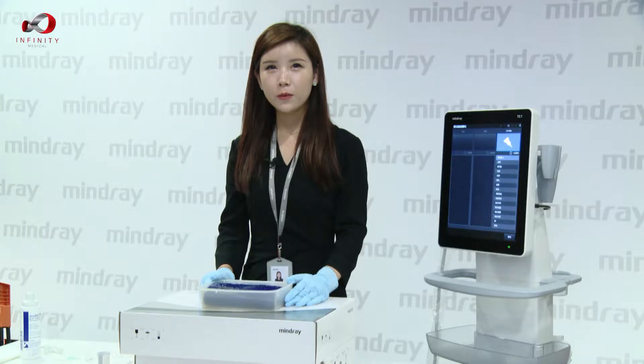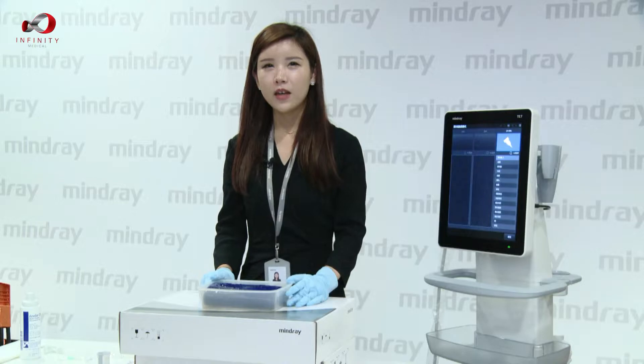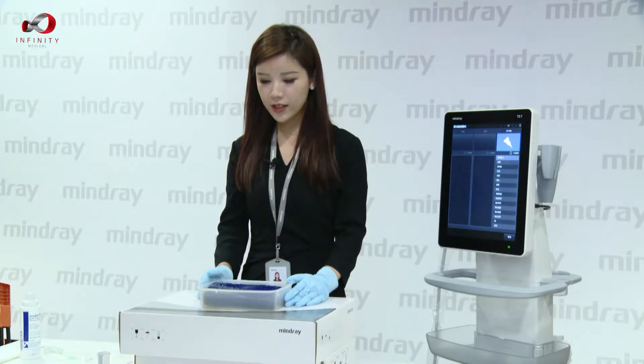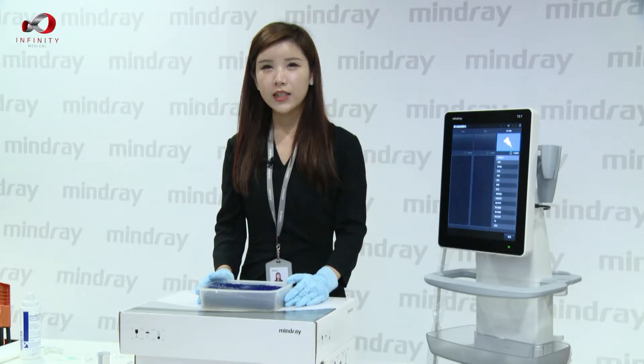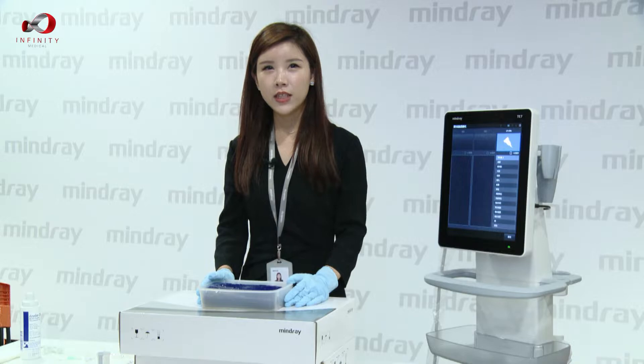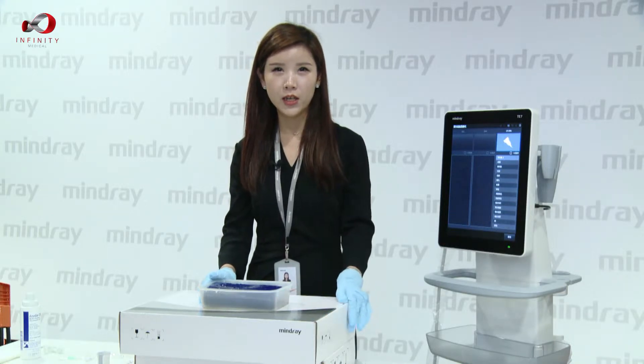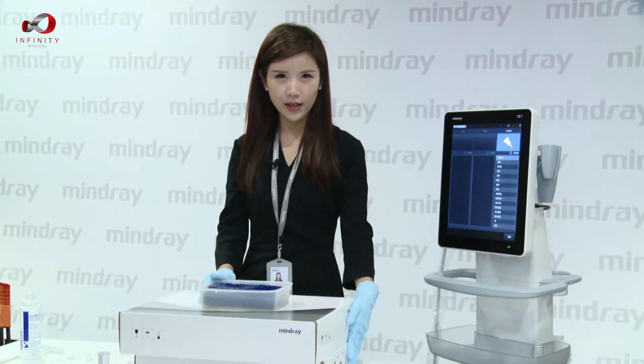The most important concept to remember is to maintain magnetic hygiene. It means that we have to keep metal objects away from our targets, such as our phantom. It is better to lift the phantom 30 cm away from the table if the table is made of metal, like this.